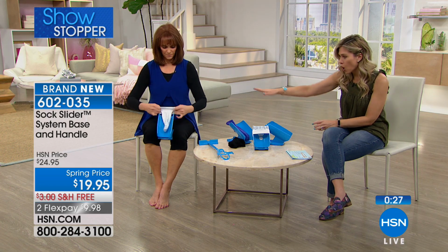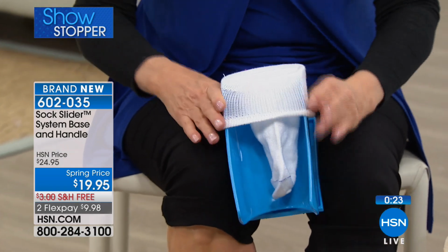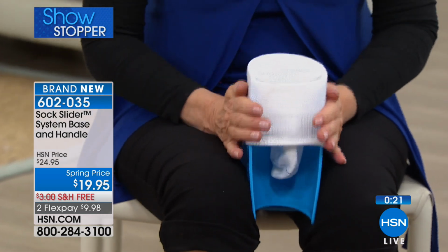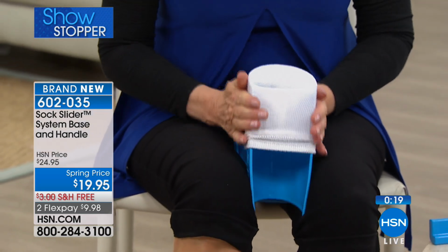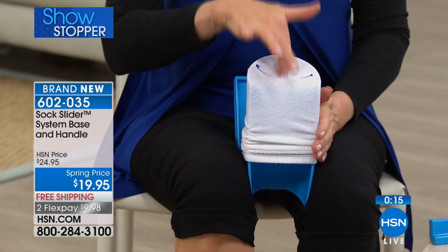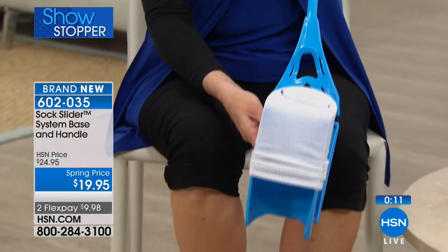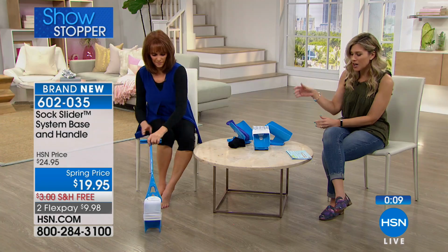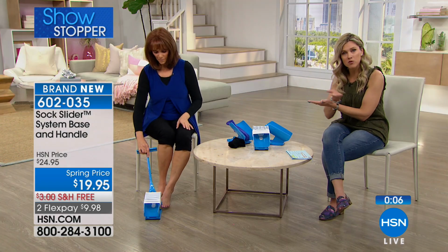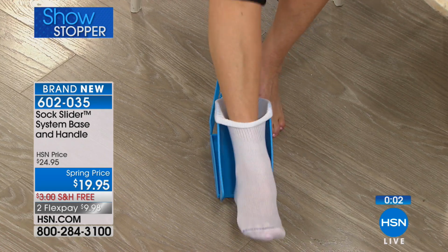You'll put your sock on the base. That's all you have to do. That's the hardest part, just putting the sock on. But most socks have really great stretch. You slide that over until you see the toe area come to the edge. That's where you'll use your wand or your specialized handle. You'll clip it, put it on the base on the floor, and remember those rubberized, non-skid, non-slip, and then you slip your foot in.